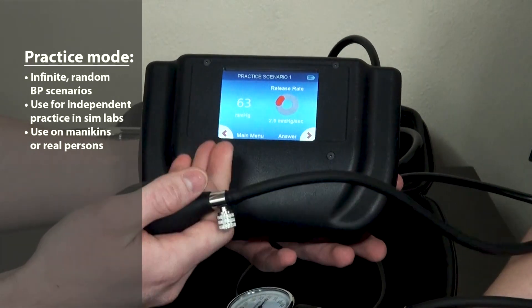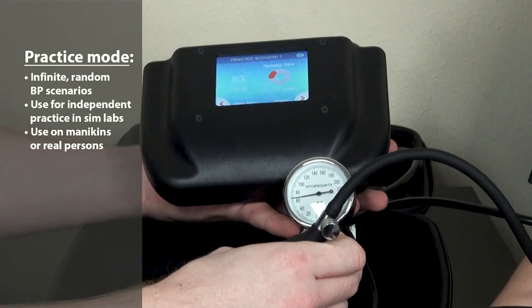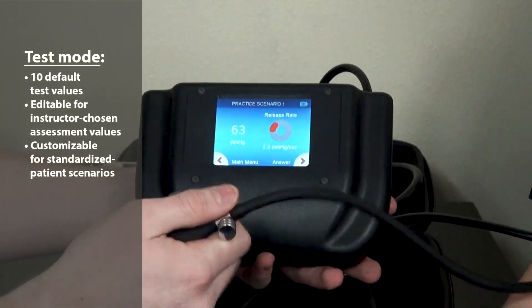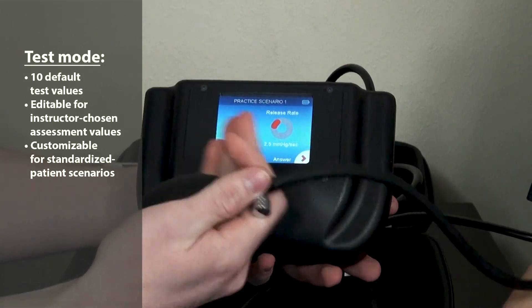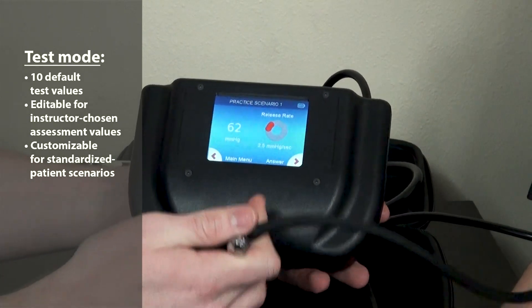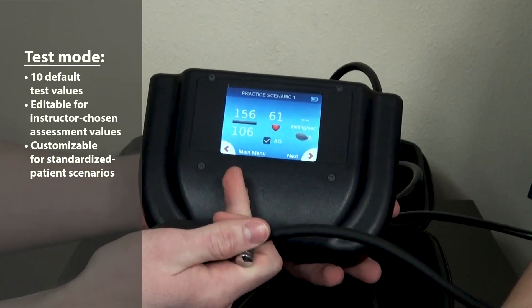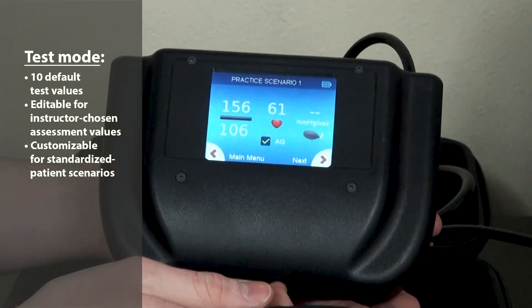This screen depicts the pressure within the cuff, which is also shown on the analog gauge, as well as the release rate showing a too low, too high, or correct release rate. The next screen shows your blood pressure answer, heart rate, as well as your average release rate.